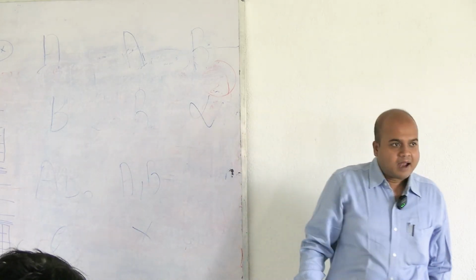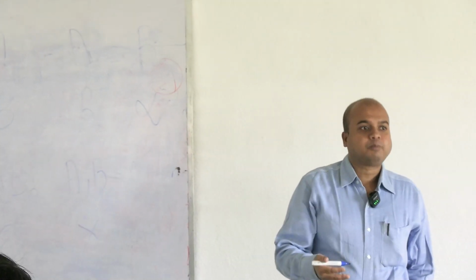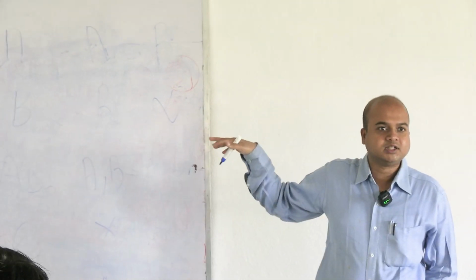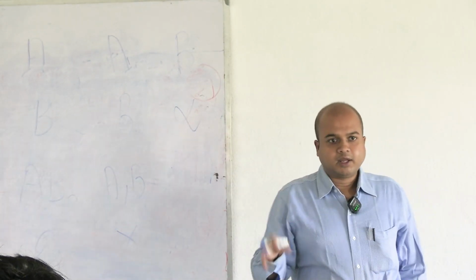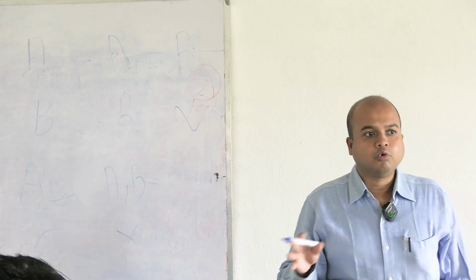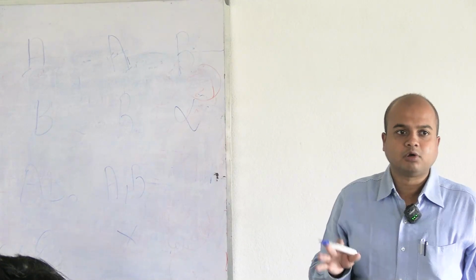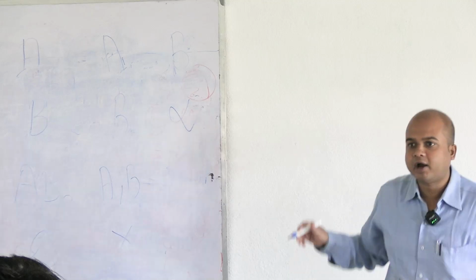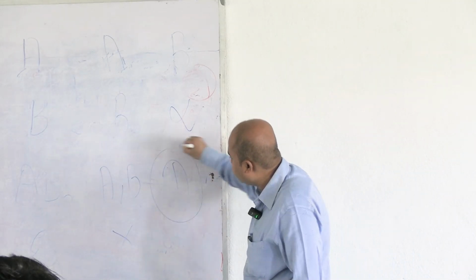And when the RH system was described, what we call RH positive is this positive. RH is after the name of rhesus. It was first isolated from a specific group of monkeys called the rhesus monkeys, RHESUS. So in RH positive, the agglutinogen is D, capital D.